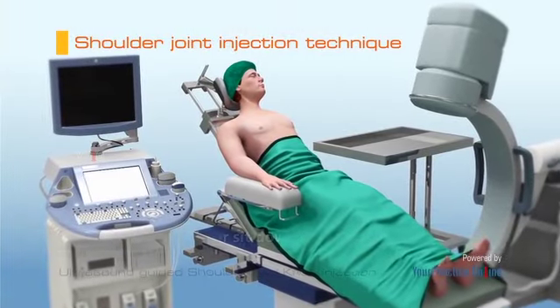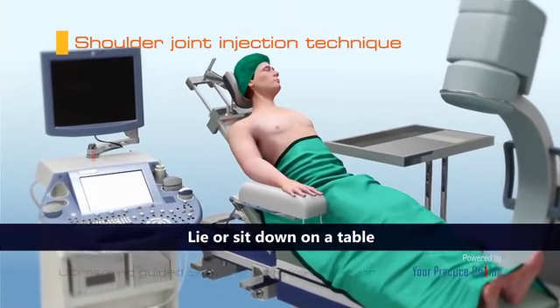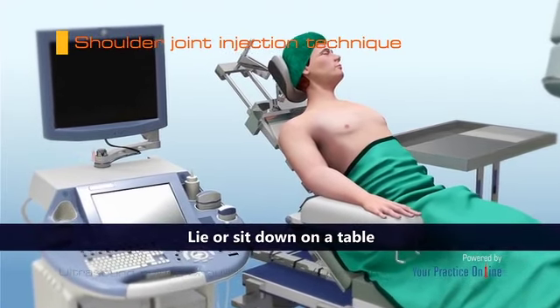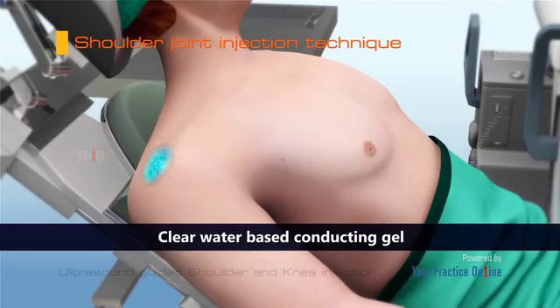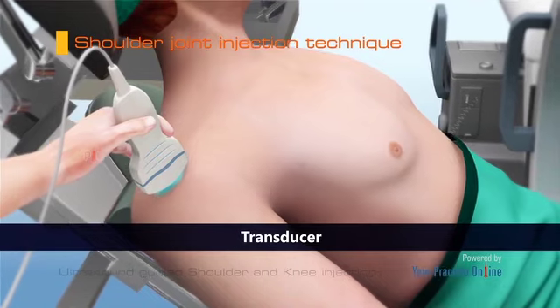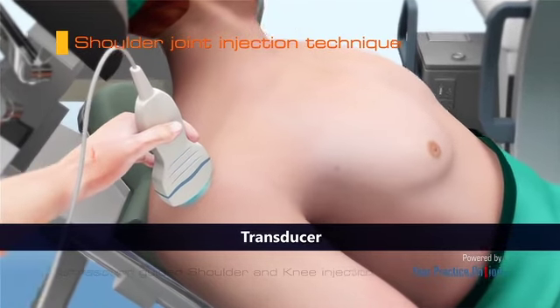During an ultrasound-guided injection, the patient will be asked to lie or sit down on a table, depending on the site of the injection. A clear, water-based conducting gel is applied over the skin to assist with transmission of the sound waves. The doctor moves a handheld probe called a transducer over the targeted area.